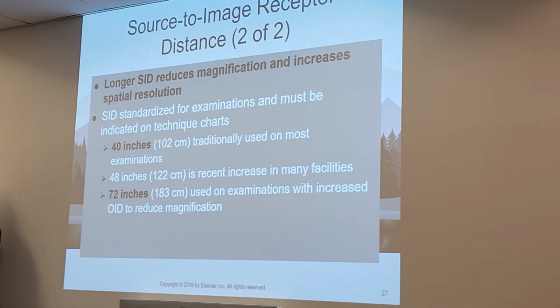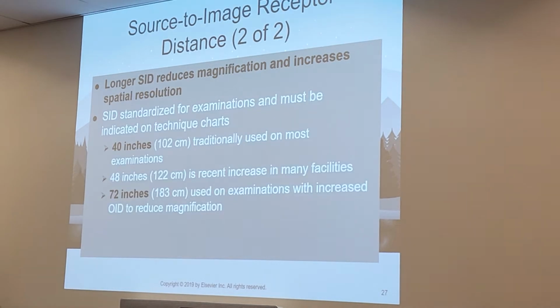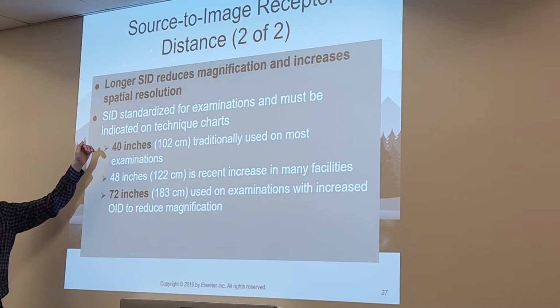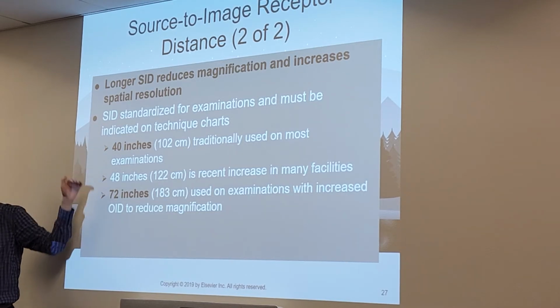So when we were in the lab, we would move a certain distance and it would stop at like 58 or 59, and we don't have to worry about that one. You do not need to worry about those. So yes, in lab, your tube stopped at 125, 72, 59.5, and 40. Do not worry about 125. Do not worry about 59.5. The ones I would like you to focus on are 72 and 40. Be aware that others can exist, but the main ones are going to be these two.